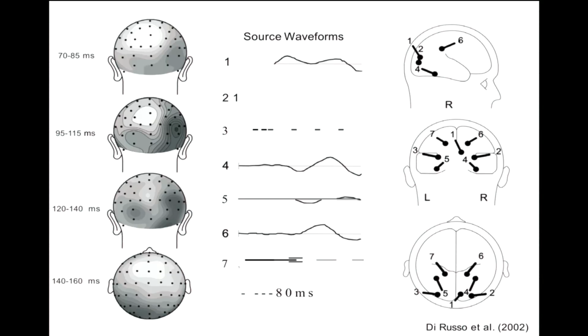What this shows is an experiment, and it is not important which experiment it is. Here you can see at this time period these dipoles are approximated. At other time periods some additional dipoles appear, and later a little bit of reorientation of the dipole. And naturally, because it is a model, every time you fit you can calculate how much variance is explained. So it is a goodness of fit. It is a simple kind of approach, but serves the purpose at the beginning quite well: simple dipole approximation by equivalent current dipole.